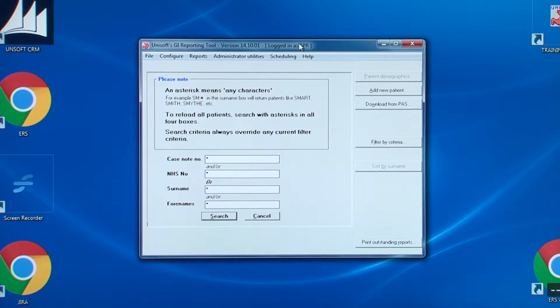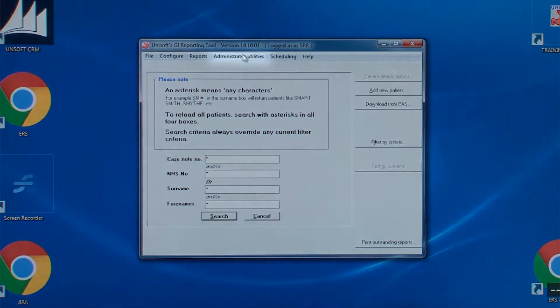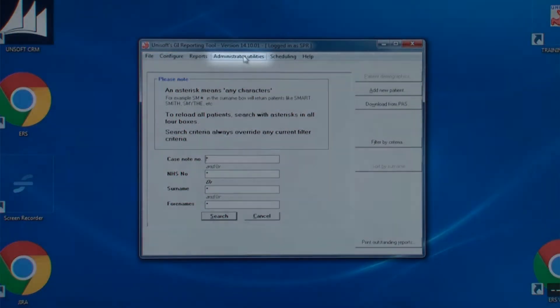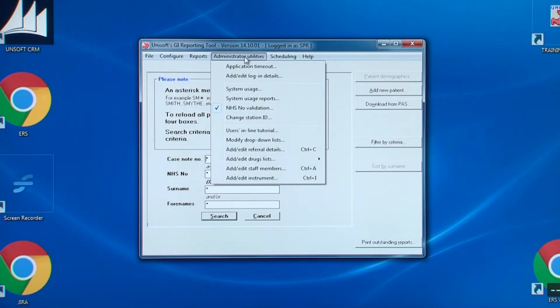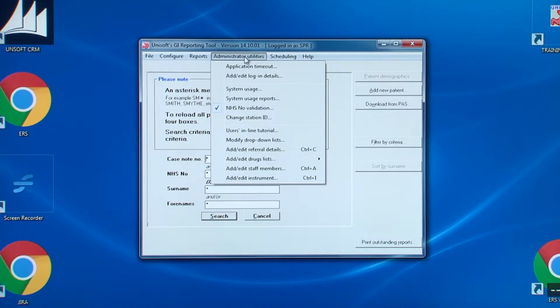That covers the configuration menu. So now let's look at the administrator utilities. This menu is enabled if admin or an administrator is logged in. It will be greyed out if a regular or read only user is logged in.